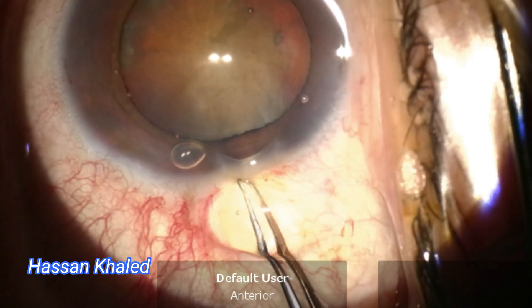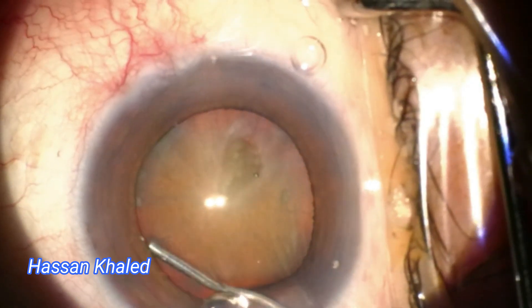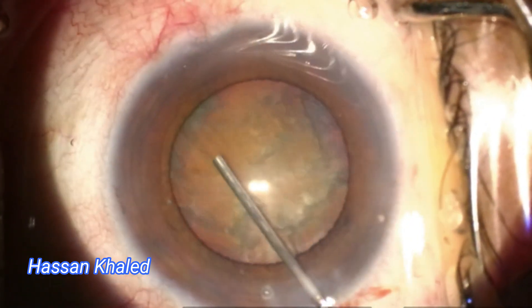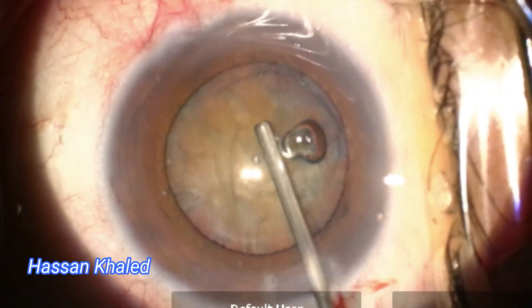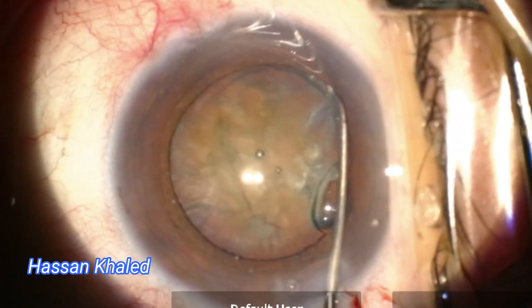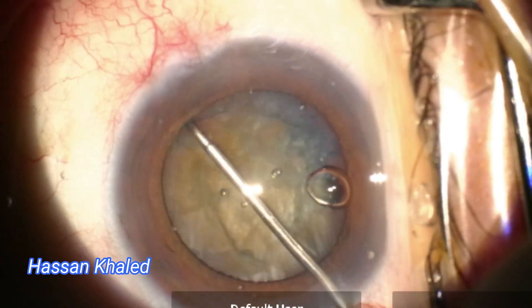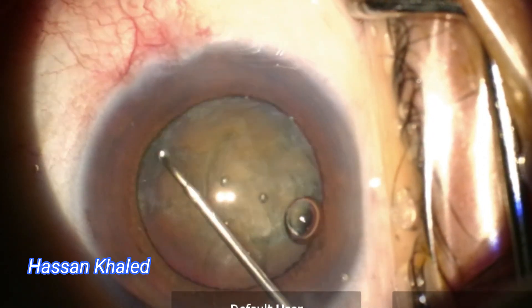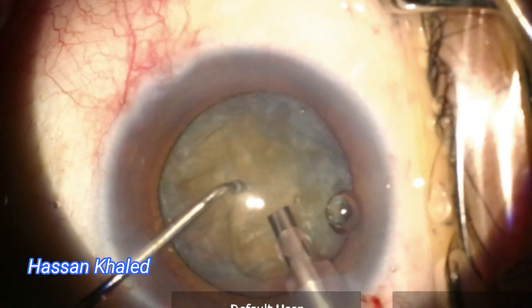After that, I emptied the anterior chamber of viscoelastic slightly, then performed hydrodissection. Unfortunately, because of the density of the cataract, the posterior wave was not clear. Trying to rotate the nucleus was also difficult — I think my hydrodissection was not complete.